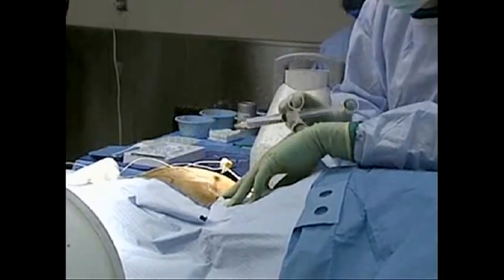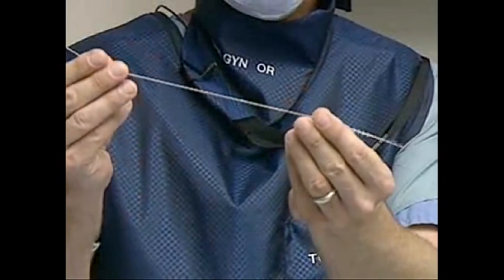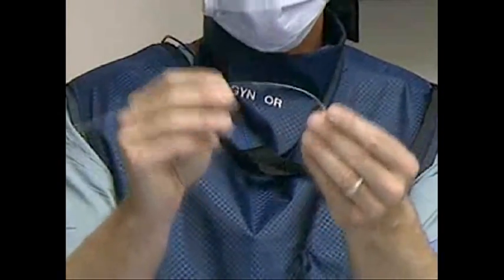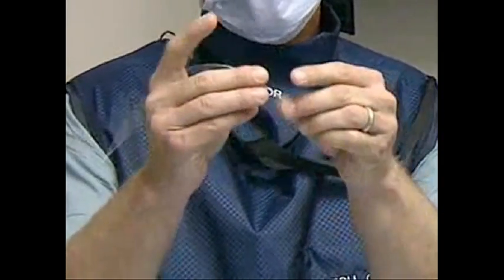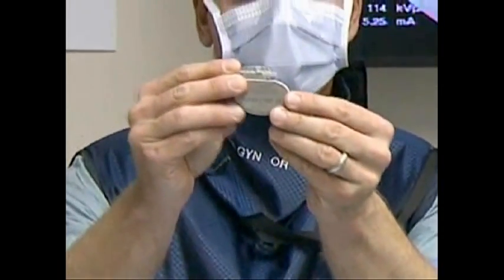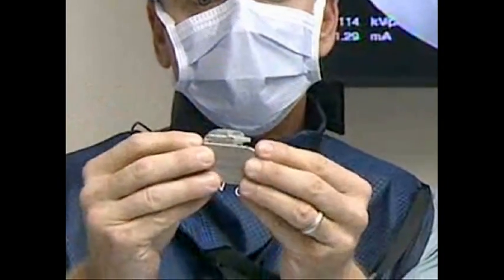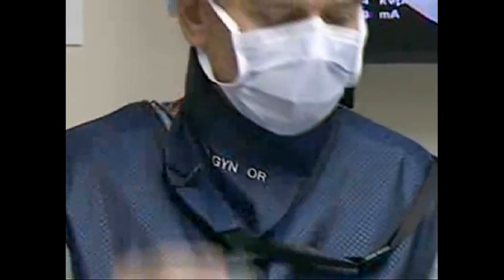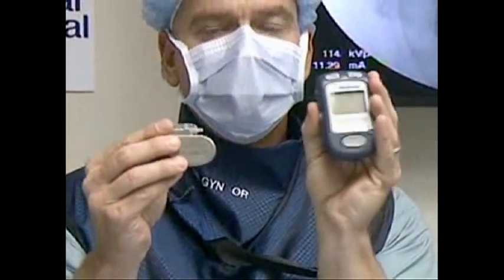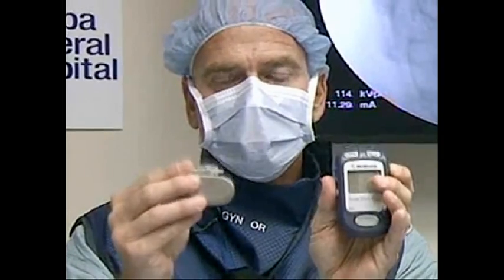When they do the permanent implant, we have this lead. The temporary lead is very fine and just comes out to the skin. The permanent lead is a little thicker but is tunneled below the skin — you will not see it; it's internally implanted. It has little tines to prevent it from migrating, which allows you to be active so the therapy continues to work. The permanent device is very small and can last anywhere from five to ten years as far as battery life. There's actually a programmer like a remote control for your TV — you don't have to connect to it; it sends a signal and allows you to adjust the stimulation to get the best results.